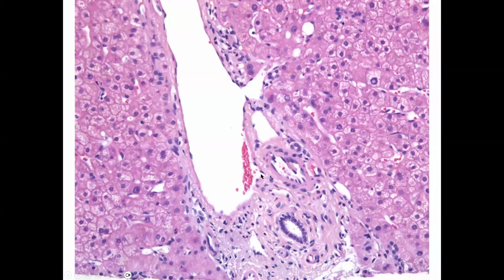These are the components of the portal tract. The large vessel is the portal vein, where most of the blood coming into the liver is carried. Then the smaller blood vessel with the thicker walls, which have a little bit of muscle, is the hepatic artery. And here, the bile duct is made of epithelial cells rather than vascular cells, and this is carrying bile.